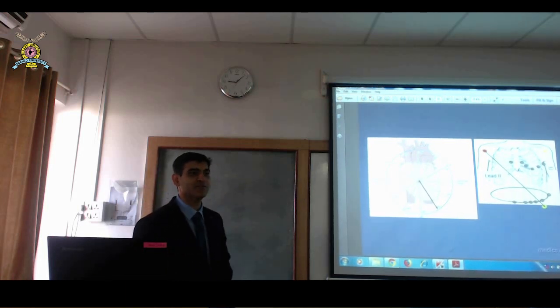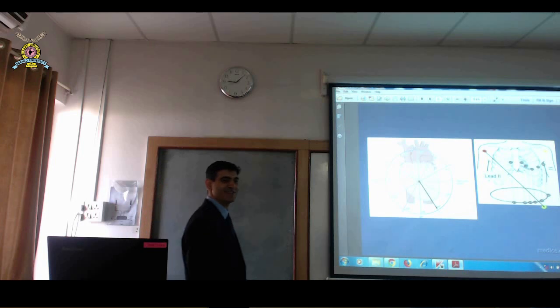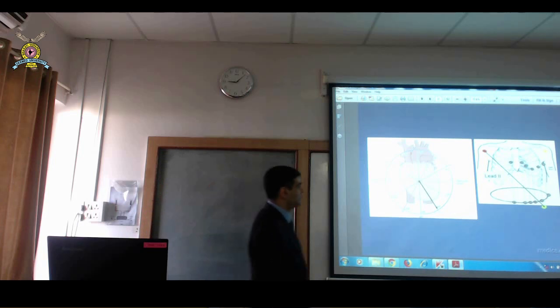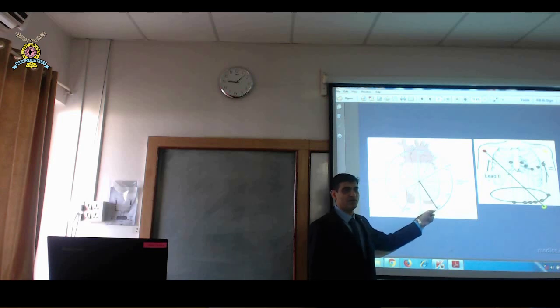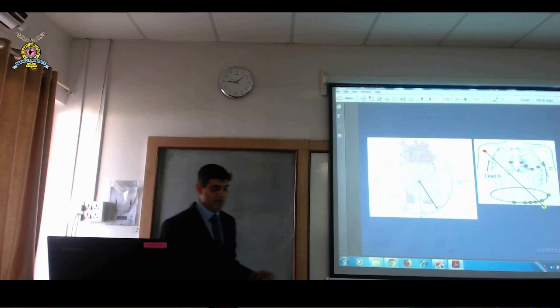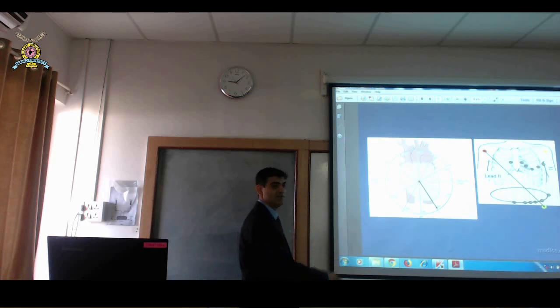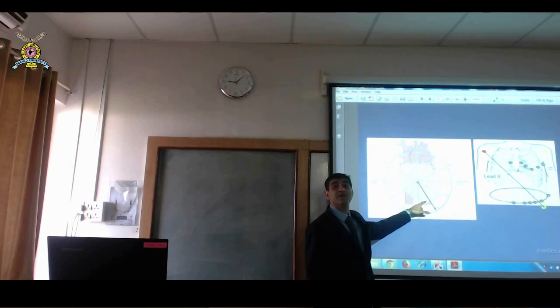Yeah, in infarction. Why does it come in negative in infarction? Because no signal is traveling in that direction. Right? As simple as that. If there is no electricity traveling because it's infarcted, then you will not get a positive here. You will get negative, because the electricity may be traveling in the opposite direction. Now, which infarction will happen here? Which wall is this? Inferior wall.